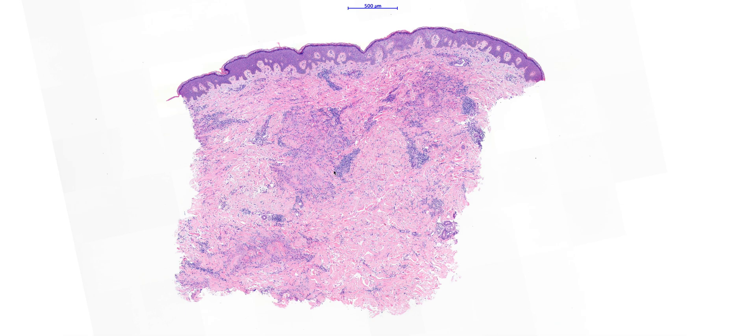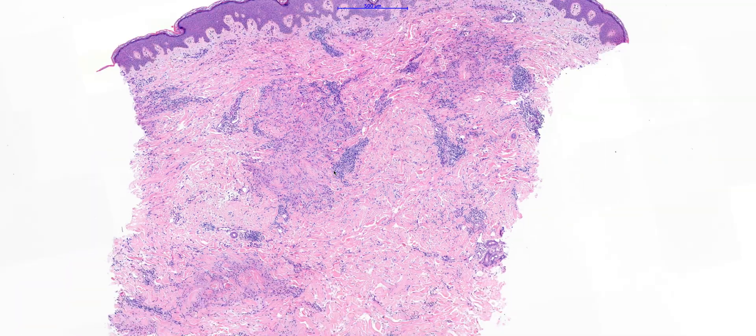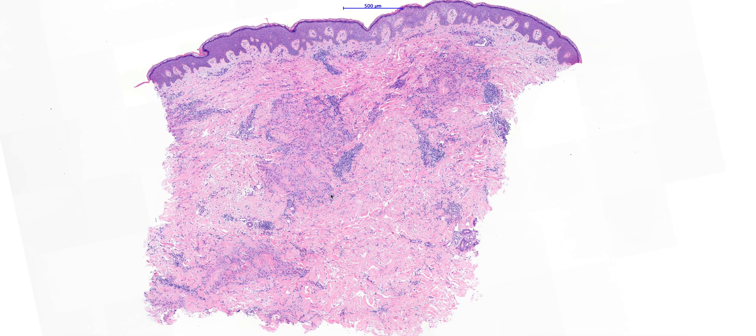In granuloma annulari, you typically get rather smaller, multiple foci of necrobiosis in the dermis. Whereas in necrobiosis lipoidica, the necrobiosis tends to be much more extensive and arranged in more parallel tracks within the dermis, often parallel to the epidermis. The associated inflammatory infiltrate in necrobiosis lipoidica quite characteristically also contains plasma cells, which you tend not to see so much in granuloma annulari.